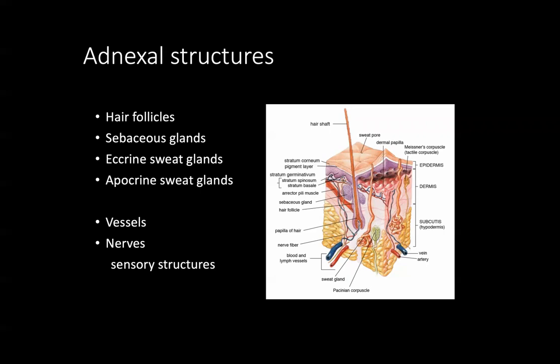You can have ectopic apocrine glands even in conditions such as nevus sebaceous. You've got a lot of apocrine glands there. Apocrine glands can be highly present around the nipple area as well and are associated with breast tissue. Apocrine glands have a specific histology that we will show examples of later in this lecture.